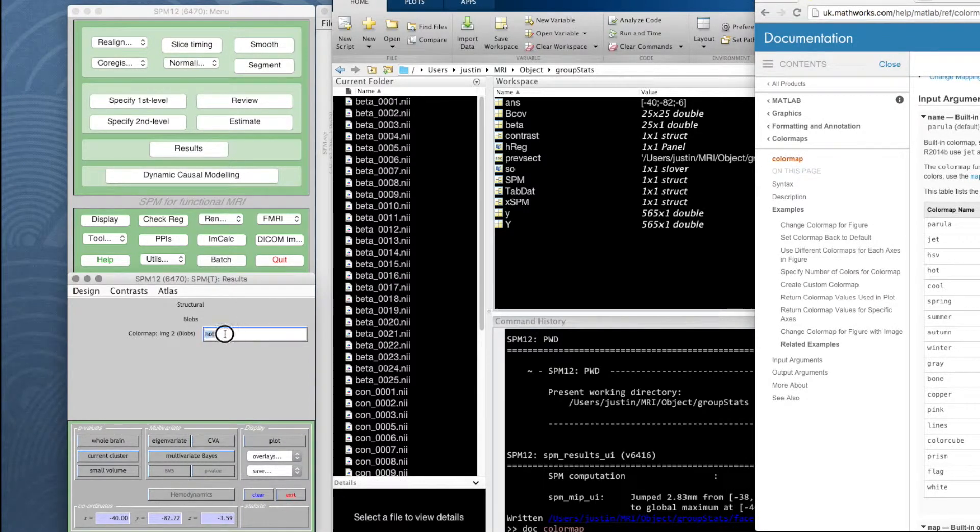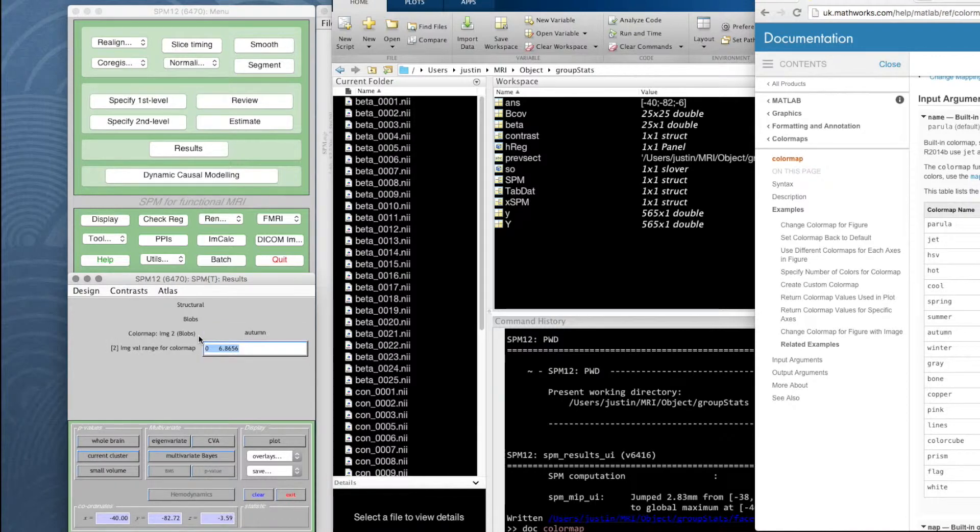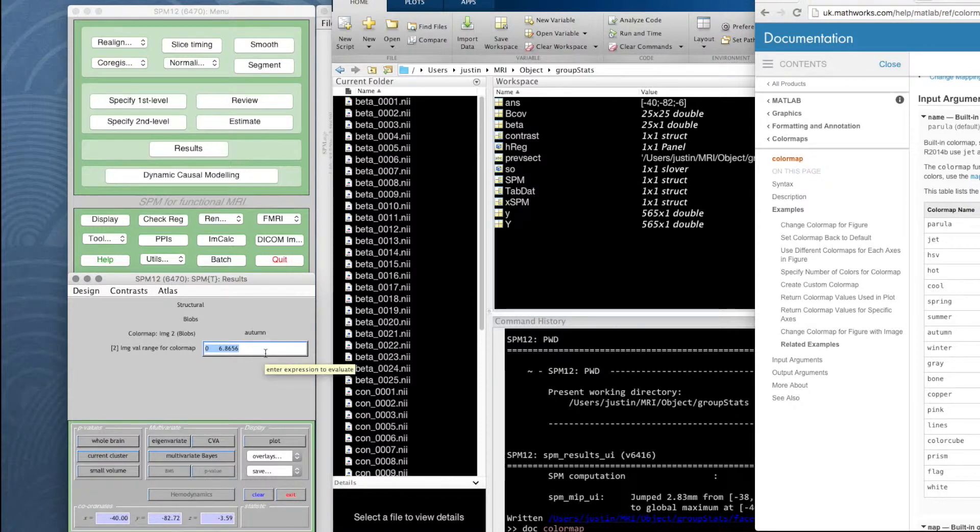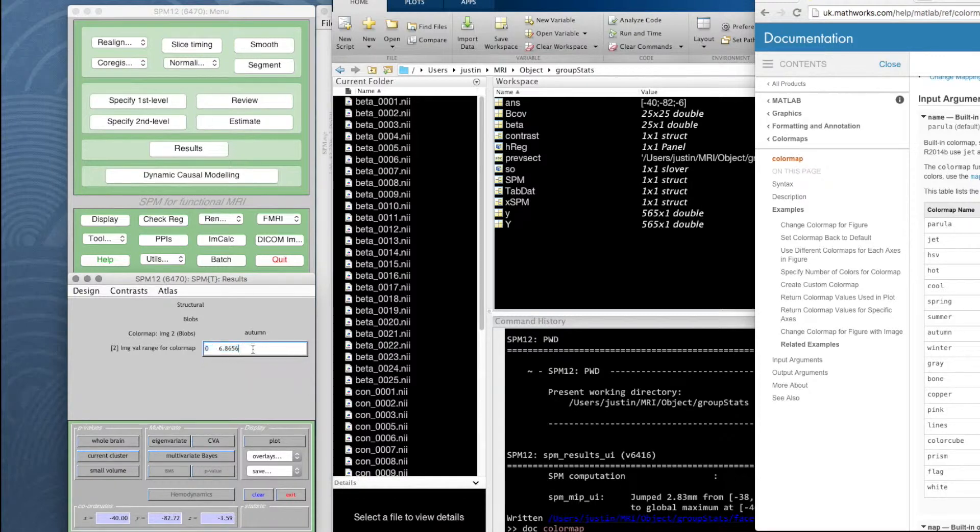So let's move that out of the way. So instead of hot I'm going to go for autumn. I wonder why they call it autumn when they use American color, they should call it fall really. It says image value range for color map. This means the SPM, that is the blobs, have t values in the range 0 to 6.9 and we're just going to use that whole range.